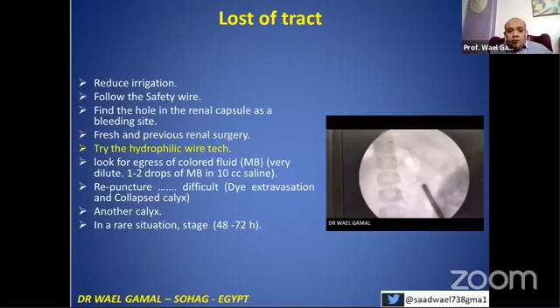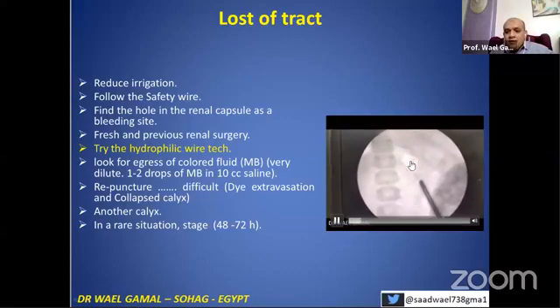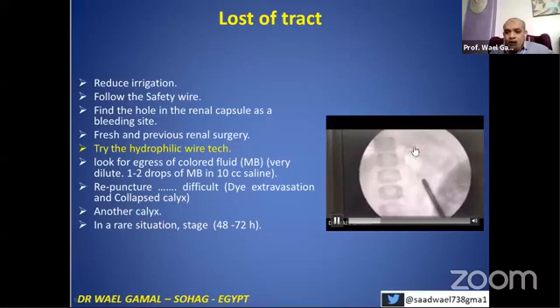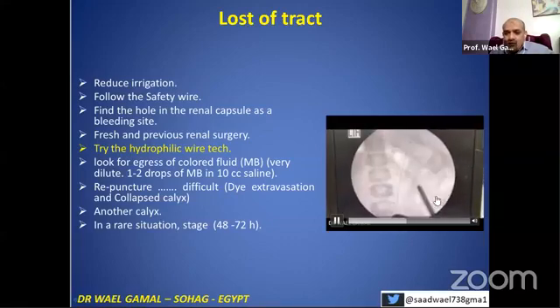How to deal with lost track: you can try this technique. You can occlude the kidney — it is a closed system. We can use a hydrophilic wire from the ureteral catheter to go up and down and try to find the opening and regain the track. This may be successful in the upper calyx and lower calyx, but it is very difficult in the middle one. Here, we pass the zebra wire — we are outside with lost track. The wire coils, searching for its way, and finds the opening in the lower calyx and exits.